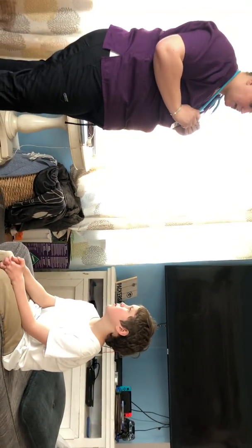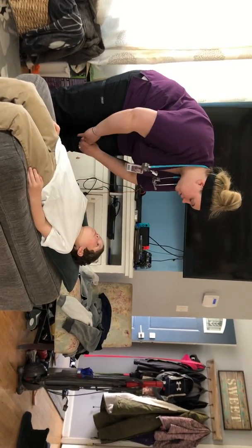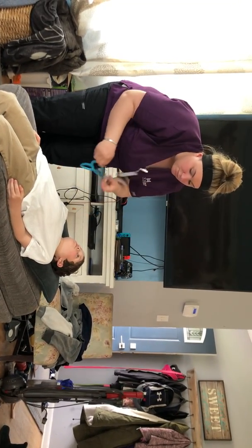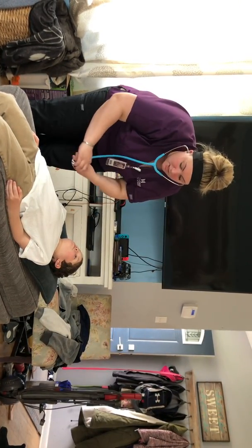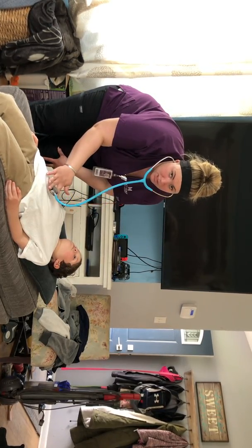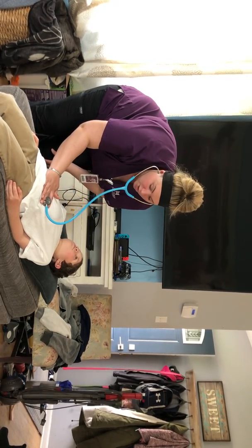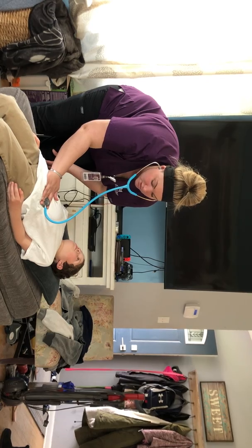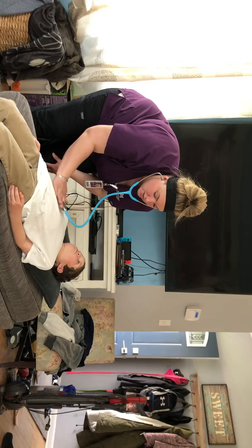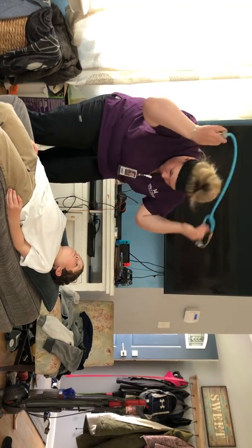Now I'm going to assess your abdomen, so go ahead and lay down. Do you have any issues with bowels that you're concerned about? No. Okay, I'm going to auscultate all 4 quadrants and listen for bowel sounds. I'm listening for 5 to 20 within a minute in all 4. Any less would be hypo, any more would be hyper, and I would listen for longer. So we've got the left lower quadrant, the right lower quadrant, right upper quadrant, and left upper quadrant. Okay, bowel sounds were noted.